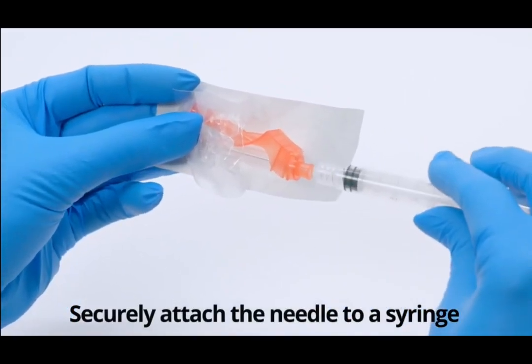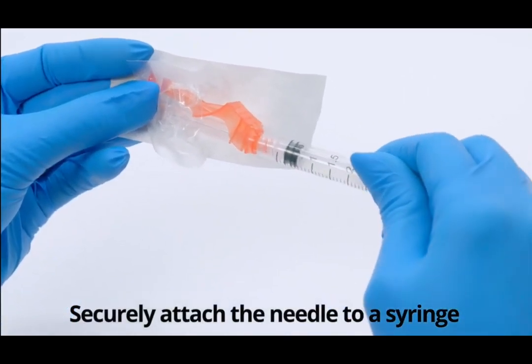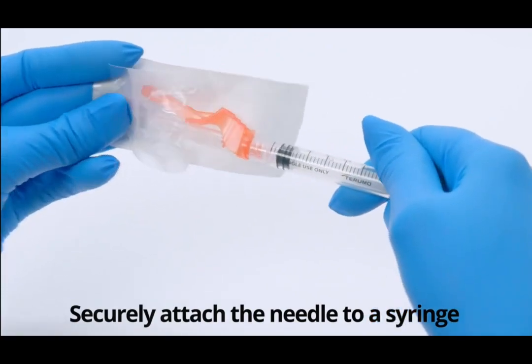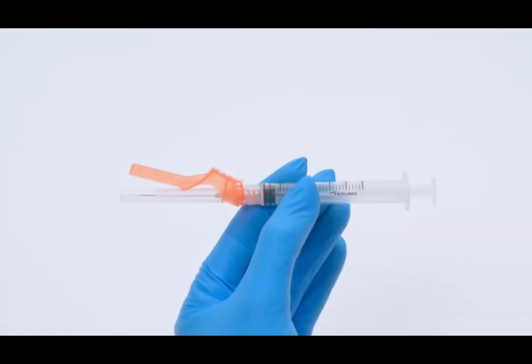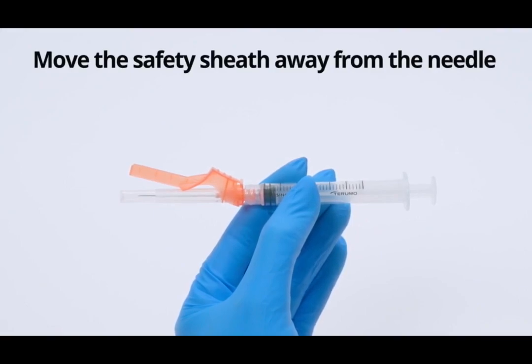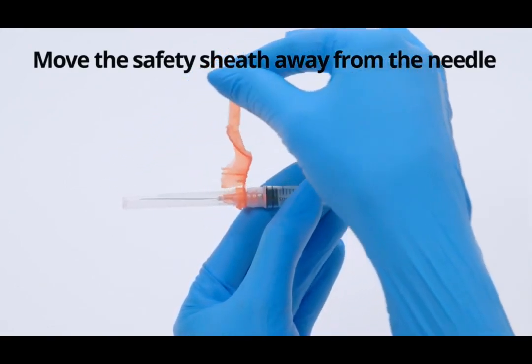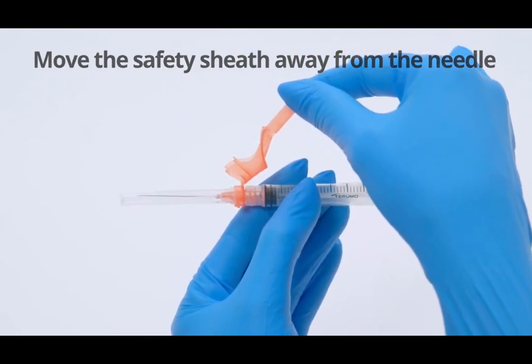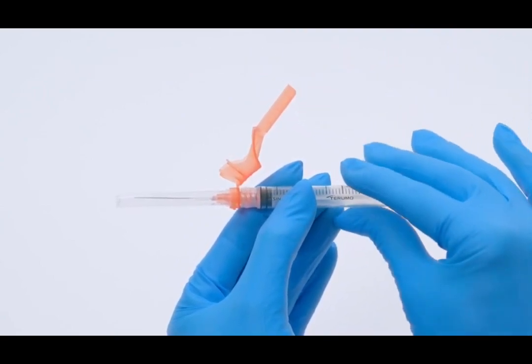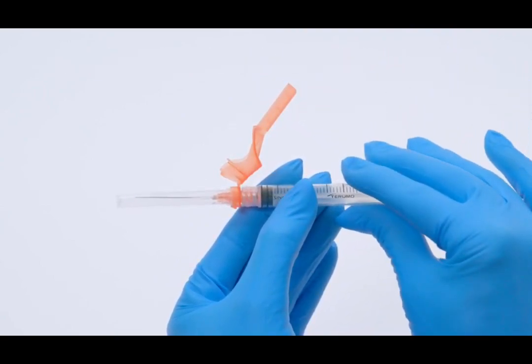Securely attach the needle to a syringe with a push and a clockwise twist motion. Prior to removing the protection cap, move the safety sheath away from the needle and toward the syringe barrel to the angle shown. The fixing mechanism will keep the safety sheath in the position you set.